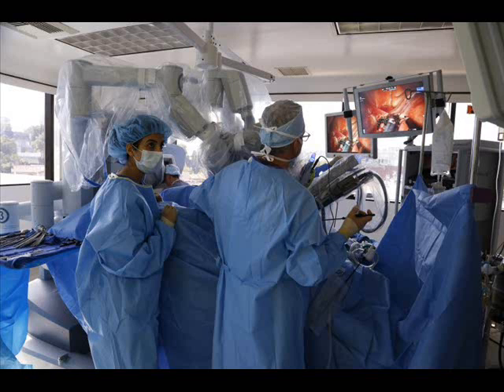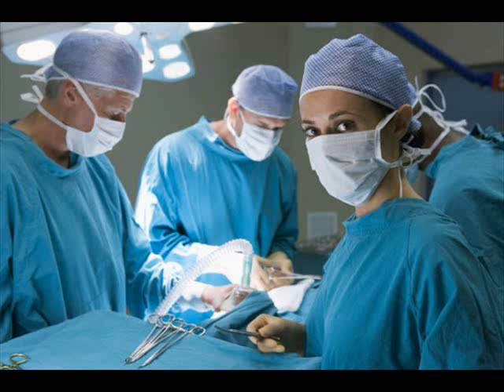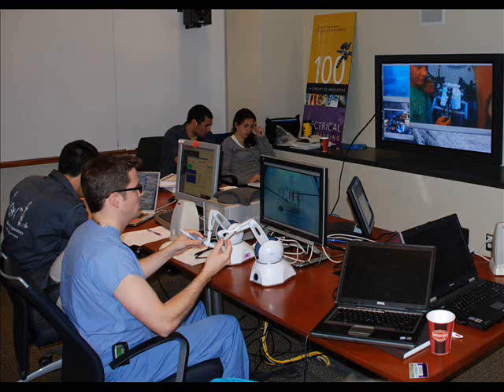Vascular surgery. In September, the first robotic operations with Hansen Medical's Magellan robotic system at the femoral vasculature were performed at the University Medical Center Ljubljana, Slovenia. The research was led by Boris Gursk, the head of the Department of Cardiovascular Surgery at the center. Gursk explained that the robot used was the first true robot in the history of robotic surgery, meaning the user interface was not resembling surgical instruments and the robot was not simply imitating the movement of human hands but was guided by pressing buttons, just like one would play a video game. The robot was imported to Slovenia from the United States.